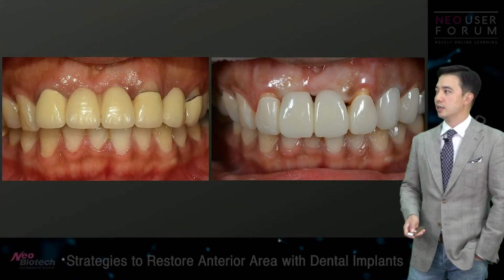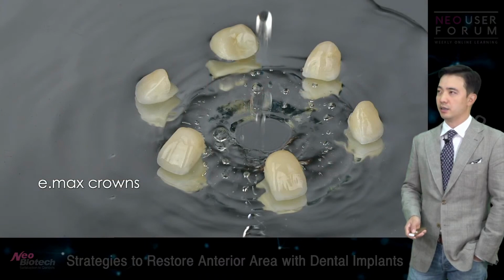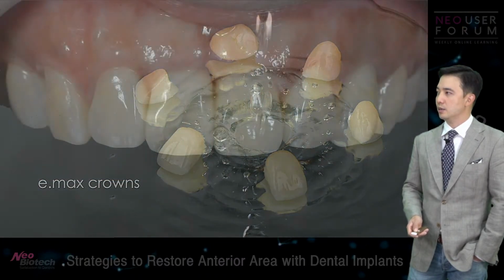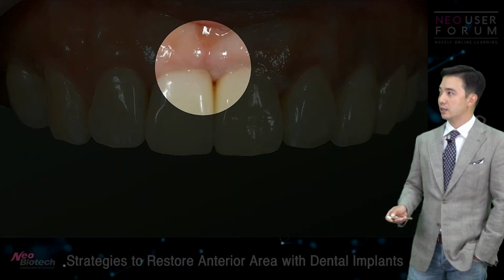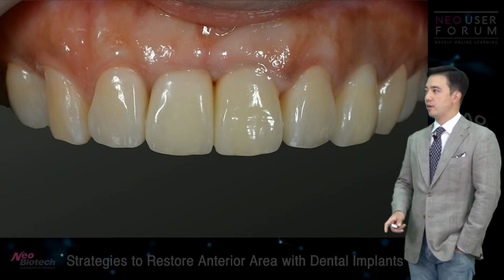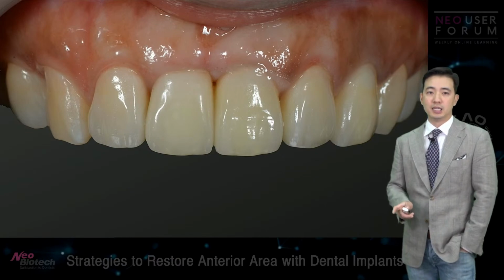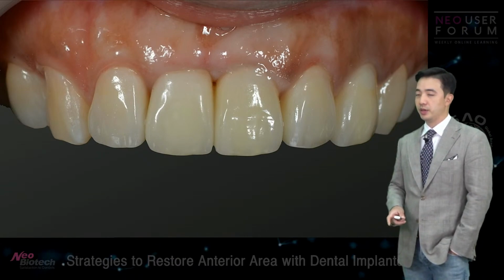And finally, after waiting a couple weeks, I think we waited for 2 weeks, we went ahead, placed the Emax crowns on it, and this is how I got the papilla for the final result. So, I mean, it's not perfect, far from being perfect, but at least it got better than the provisional restoration.